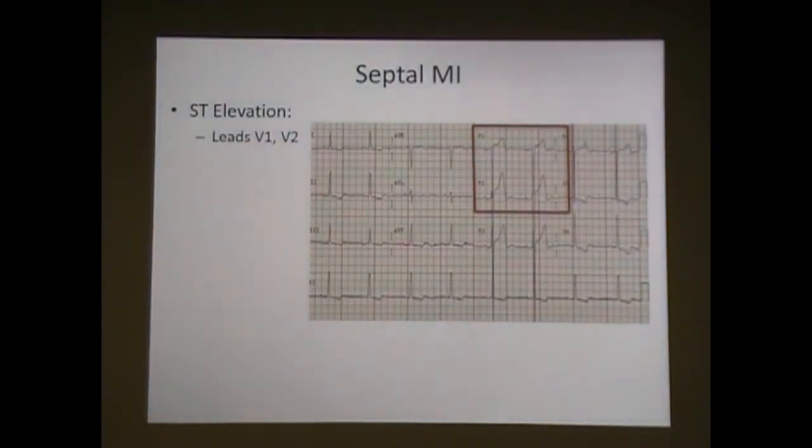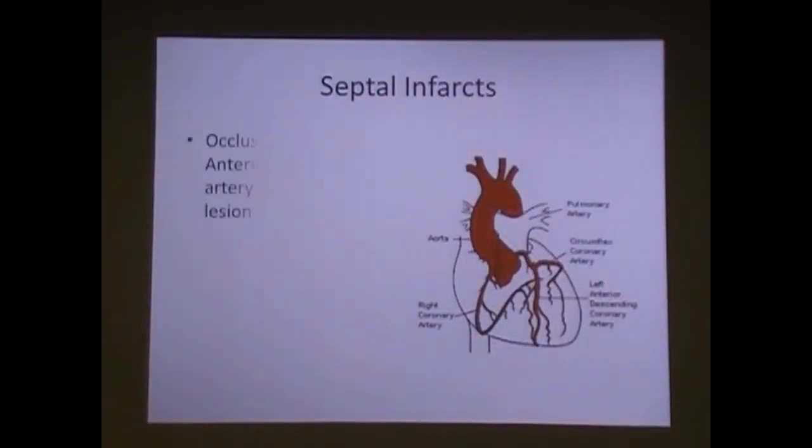I don't know why they did this, and I'll show you in a second why it befuddles me that they even call it septal MI. Okay? There are no reciprocal changes with that, even though I have possibly some reciprocal changes here. Septal MI is occlusion of the proximal LAD. So if I'm looking at that EKG and I have 3, 4 kind of going on, why would I just have V1, V2? That's what doesn't make sense to me, because I've got downstream occlusion going on here.